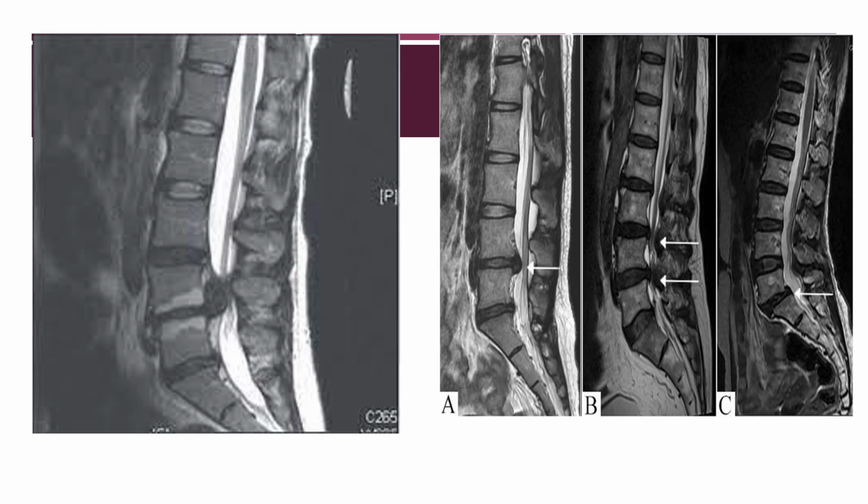And here's just another few images that you can see here just to familiarize yourself. You can kind of see we're in that same area in the lumbar spine here. Again, same area of the lumbar spine. You can see all of these herniations and even a slippage of this disc moving forward, which we're going to talk about here in just a second.